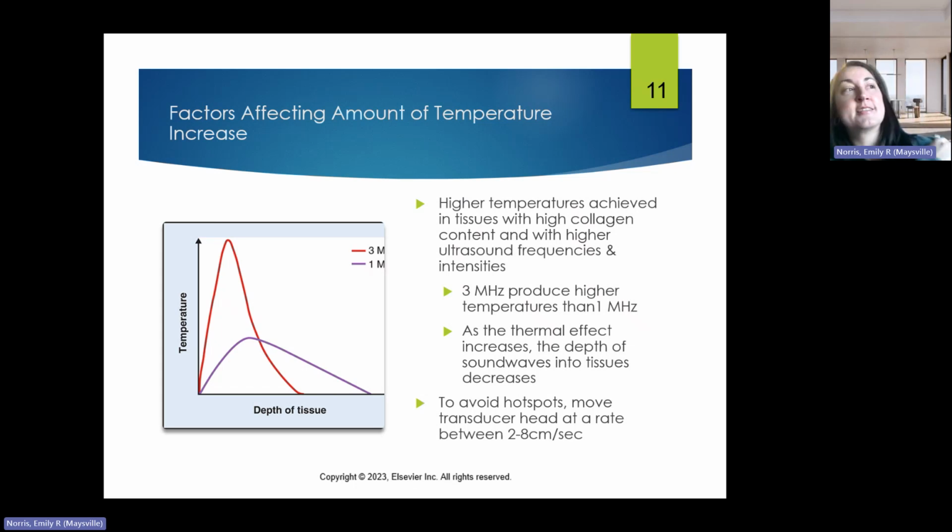She would get distracted. And if she started out here, she'd be way over here doing an ultrasound. So you want to kind of stay in the area that you want to deliver the ultrasound waves. But I would go kind of around that area and just continuously move the head. So I just do little slow circles in the area and make sure that I'm not staying over top of one place too long.